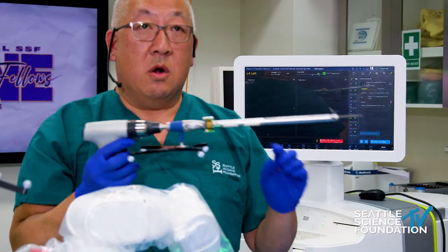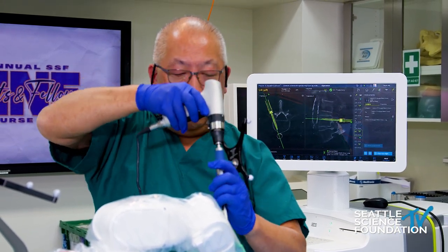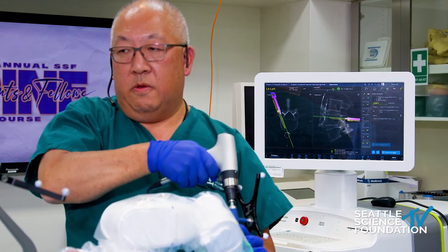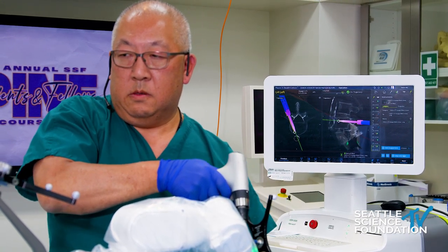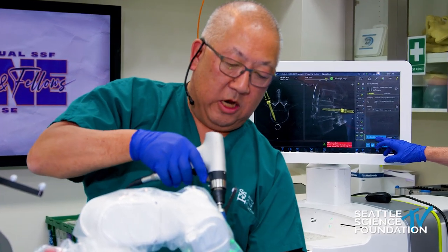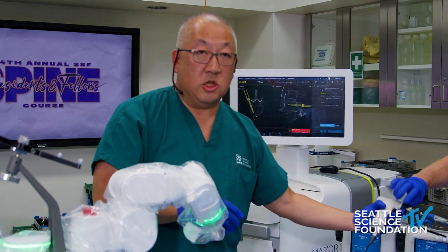With power and the ATS screw, it's very efficient and reproducible. Dropping the screw, we'll release this MIS screw system, gently remove it, and move to the left L5 pedicle position. Now I'm going to show placing the screw in two steps.